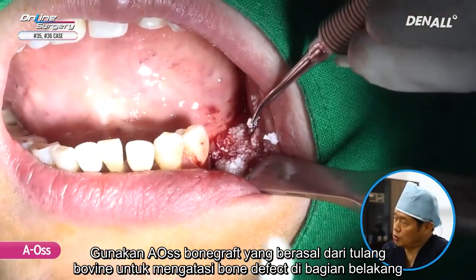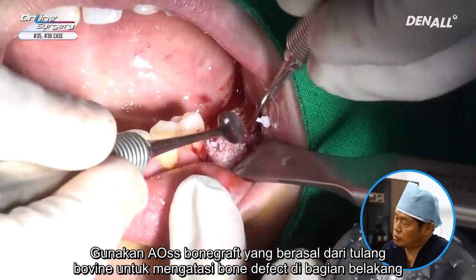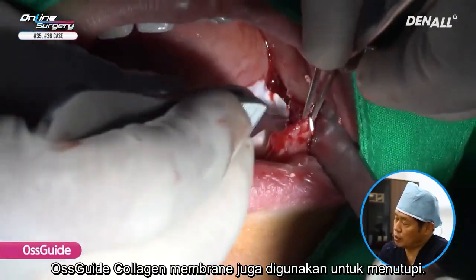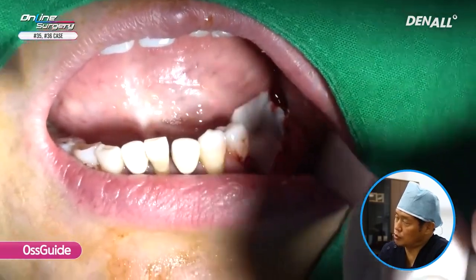On the bone defect in the back, bovine bone was used for bone graft. A collagen membrane was used to cover here.